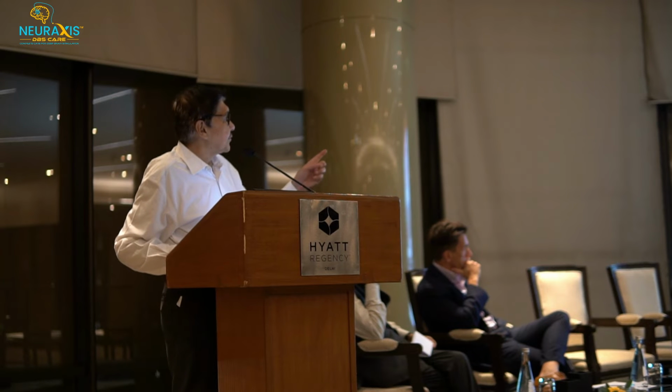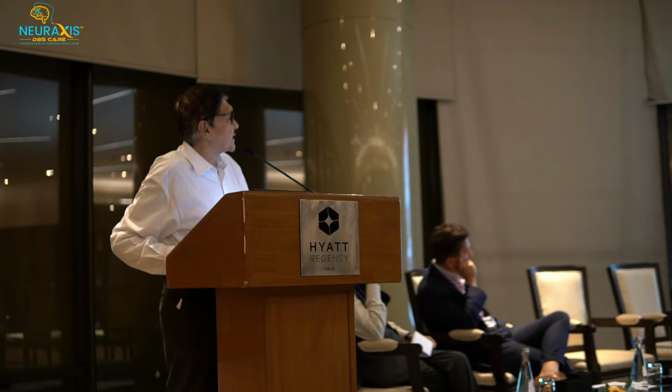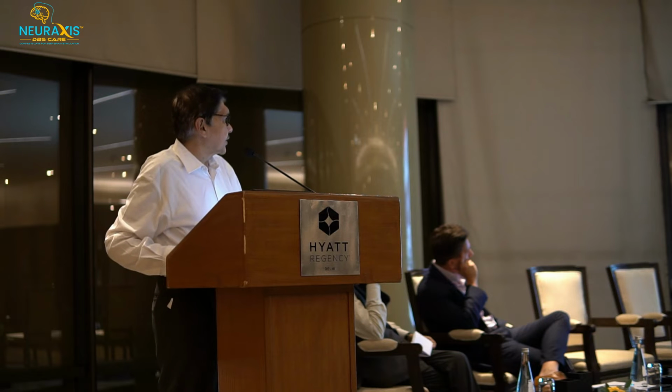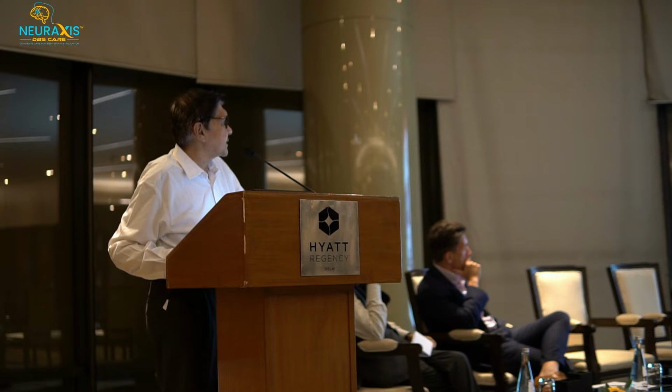For stereotactic localization under local anesthesia in the operating room, we put the stereotactic frame on the patient's head, and then again we do the CT scan, which is called the stereotactic CT scan. This is how the stereotactic CT scan looks, which is in the left corner. Then we merge the stereotactic CT scan and the preoperative MRI in the planning station, and we calculate the final coordinates.